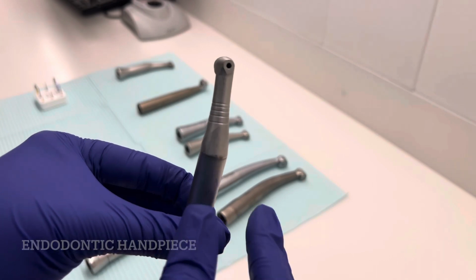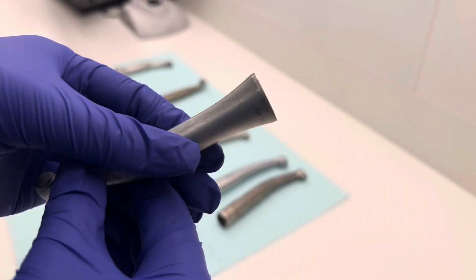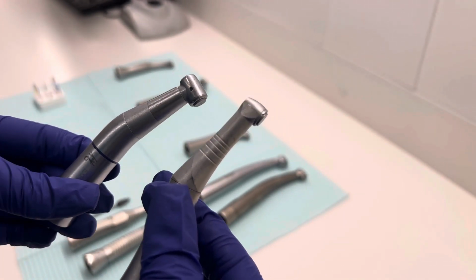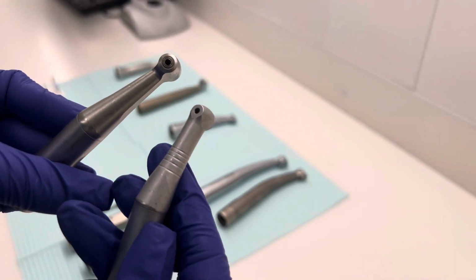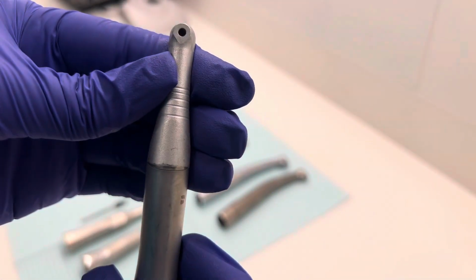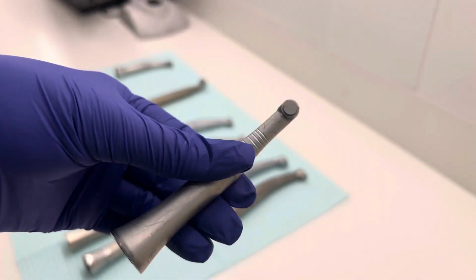Next is this endodontic handpiece, usually shaped like this. It looks very similar to the slow handpieces, and these are specialized dental instruments designed to clean and shape canals during root canal treatments. They have the ability to drive endodontic files with precision and prevent file breakage or binding in most cases. So it's very easy to mix the two up. However, it is a little skinnier than the slow handpieces, as I've shown you. And that's the easiest way to tell the difference. It's usually used for endodontic treatments, and this is how you can identify them.